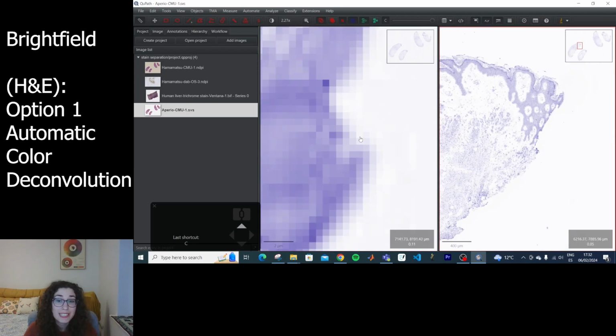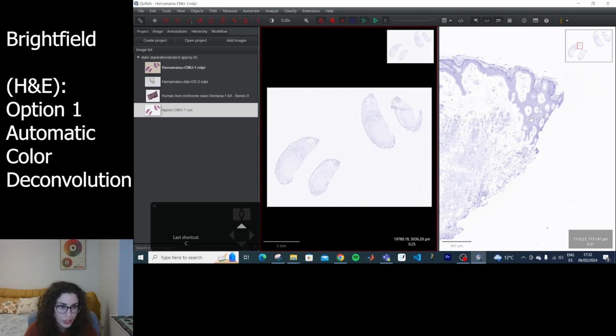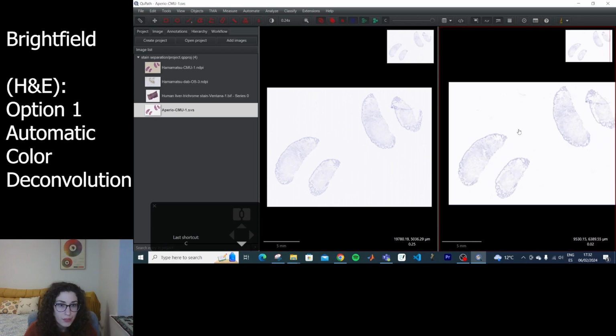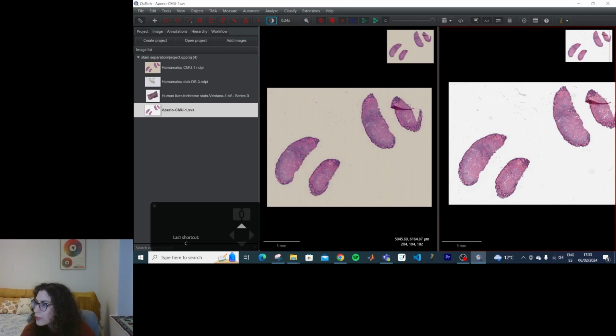So there definitely is a difference with the automatic stain separation when you use the same stain vectors, which makes sense because even though they're images of the same thing, they're not the same image, and the colors are very different. So let's create some stain separation vectors that are particular to each of the images, and let's see how different they can be. The tutorial says that we have several ways of doing this.